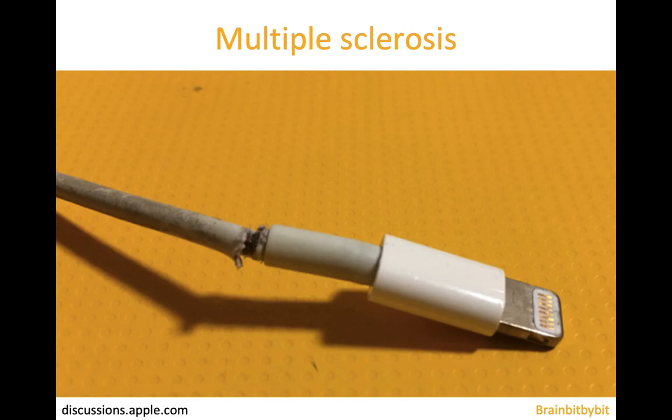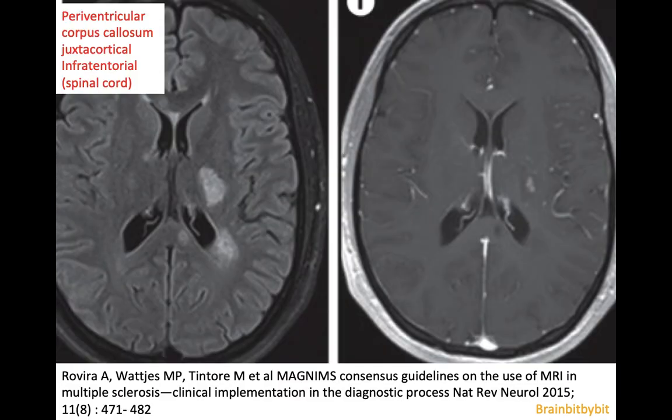Bit by bit I'm going to show images of multiple sclerosis. When you see an MRI of the brain with white matter lesions, it is important to distinguish lesions at locations typical for multiple sclerosis from aspecific white matter lesions.